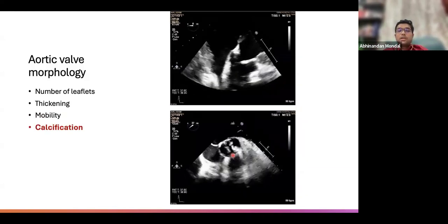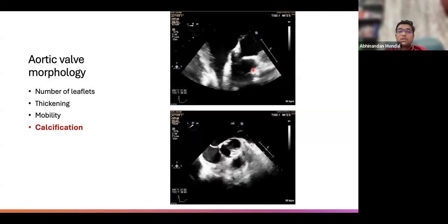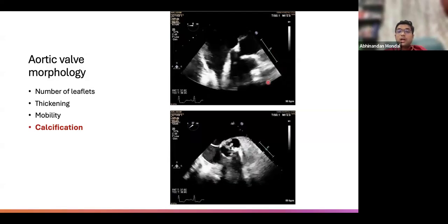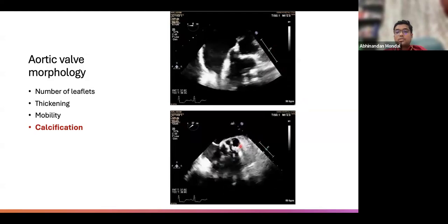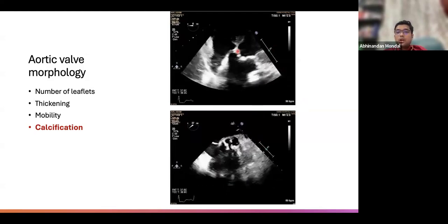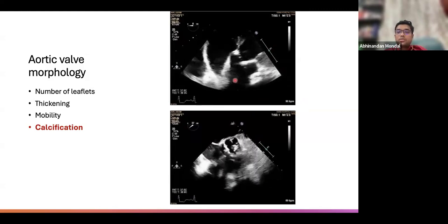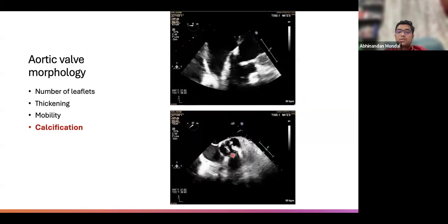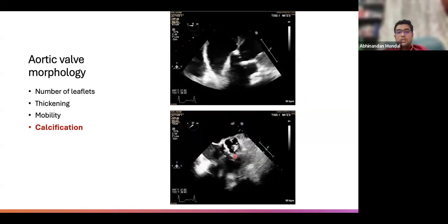And the final thing, we'll have to see is the calcification. Now you can see nicely what calcification looks like. This is your normal myocardium, the other myocardium. You can see over here it is far more whitish in color. So this is your calcification. So it is a bicuspid aortic valve with calcified margins.